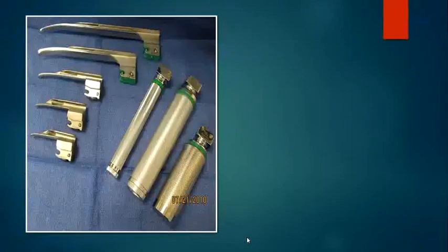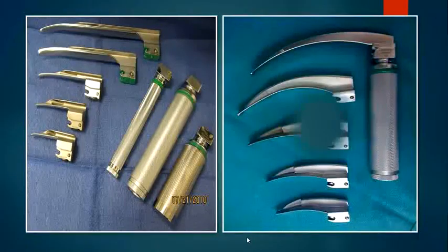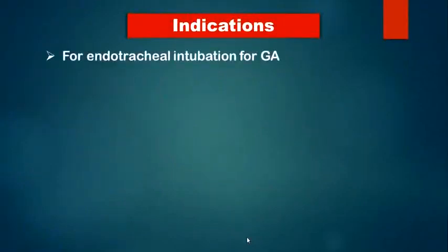Now, you can see here there are different sizes of the blades and even the handles for both types, used starting from the neonatal period up to the adult size. What are the indications of using the laryngoscope? Of course, for intubation.